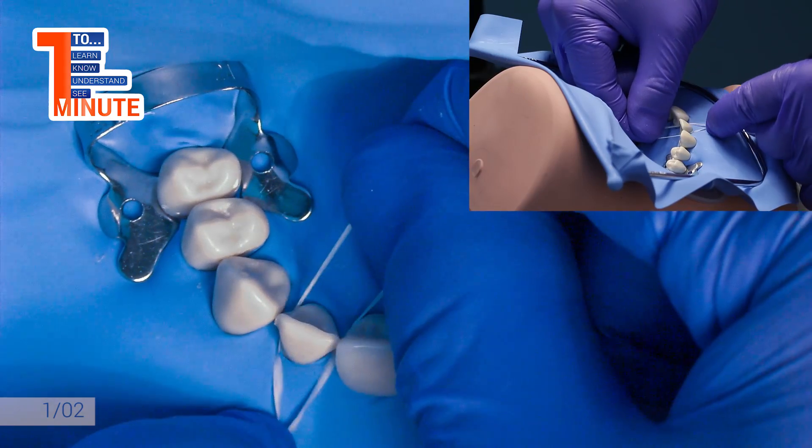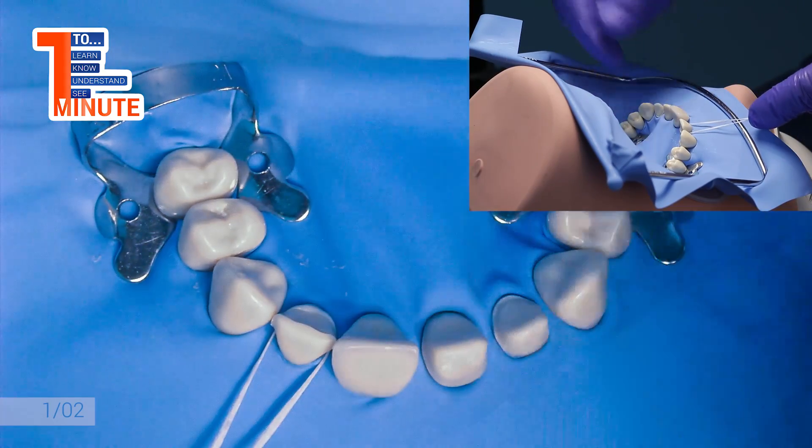This time on educational video 1 minute, we will show you a trick with single tie floss for rubber dam isolation. This technique is very useful for cervical isolations, especially during veneer bonding.